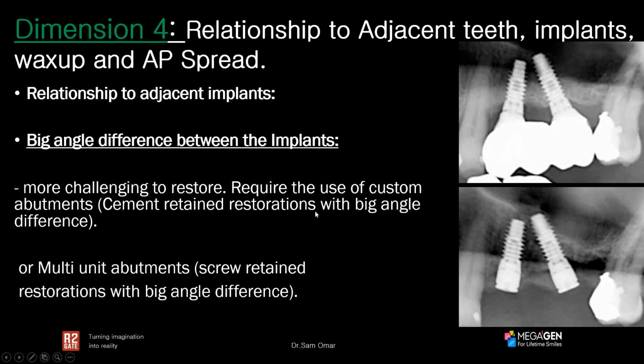So in a nutshell, make sure that when you're placing your implants, ideally place your implant straight. Number 1, that'll make the prosthetic procedure a lot easier, and will also reduce the overall cost of restoring the implant.